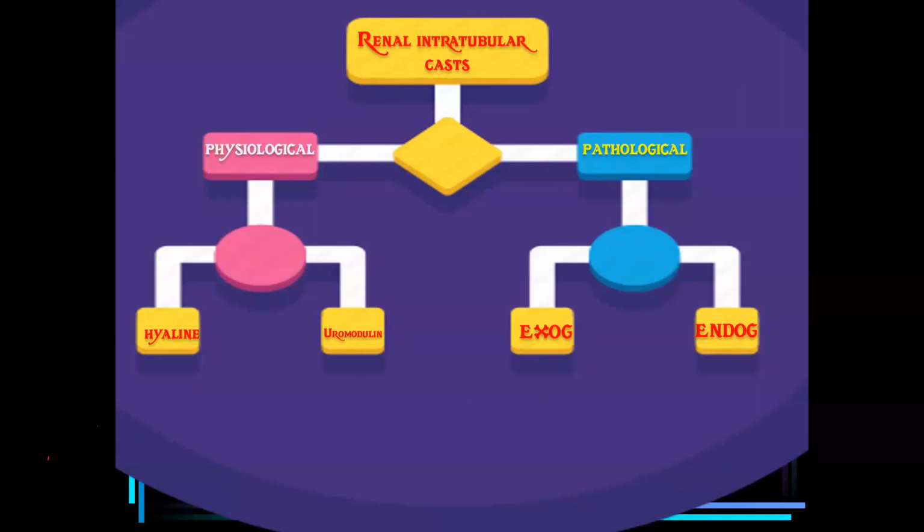In fact, I specified the drug-induced cast nephropathy, and in particular in this exogenous form, I emphasize the vancomycin-associated tubular cast nephropathy. It is one of the lesions encountered in the kidney in people who are exposed to vancomycin, resulting in the formation of special casts inside the lumen of the renal tubules, together with either tubulointerstitial nephritis or acute tubular injury, as we are going to see later.